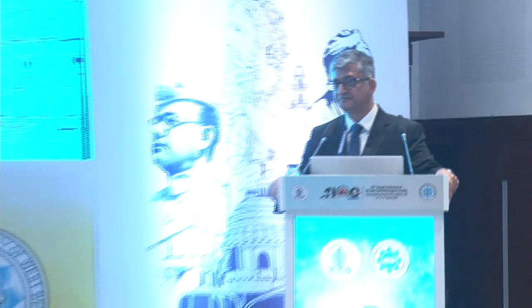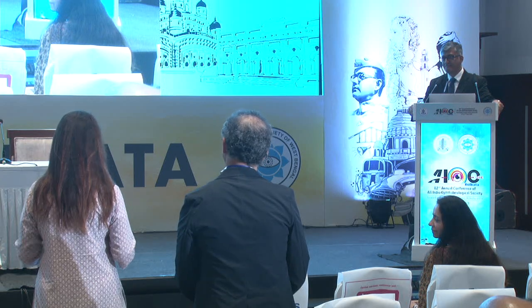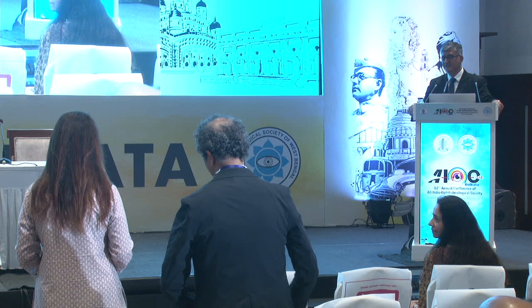Just to comment on the LALs, I would say that with LALs, you can only correct up to 3 diopters of astigmatism and 3 diopters of myopia or hyperopia. And for low levels of keratoconus, I have found you can get some good results. However, I just caution, the LALs are great, but I use caution even with keratoconus there. I think just like with the toric lens, there is some utility. However, it's not the panacea.